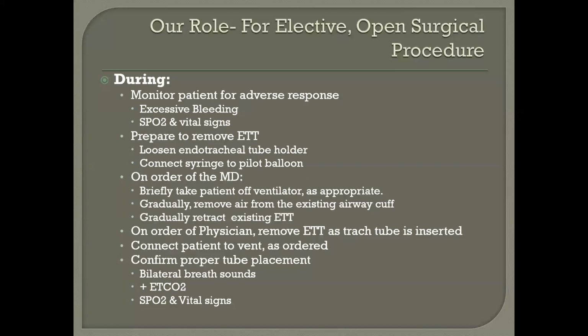And suffice to say that our peak airway pressures went up, and the patient's SATs went down precipitously. We're not getting end-tidal. The only way we were able to ventilate them was when I retracted the trach tube almost all the way. In other words, it wasn't quite out, but it was out of the false track. And we could then get end-tidal back. We could then ventilate the patient.